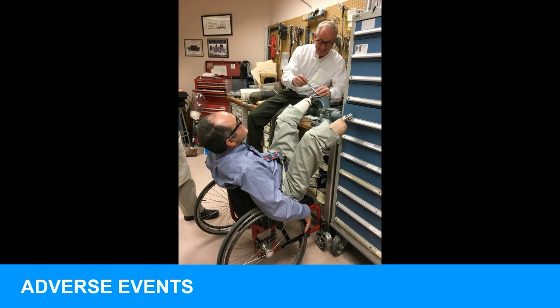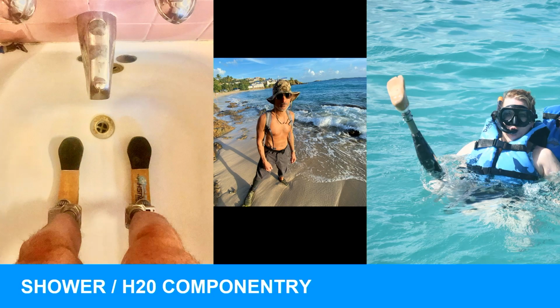But you're going to see some things in your life that you'll be shocked, probably shocked about. Dr. Stoneback, at times, I know Dr. Almuderis is, Nikki's in the room. I think to drill out a dual cone, if it breaks, possibly 11 to 12 hours in the OR. I can't imagine anything worse. Yeah, being in a patient, 11, 12 hours.